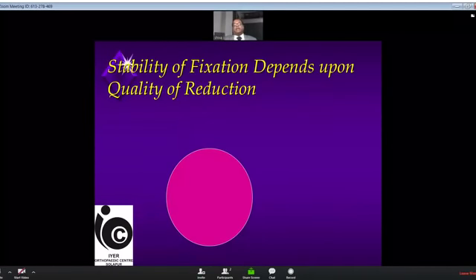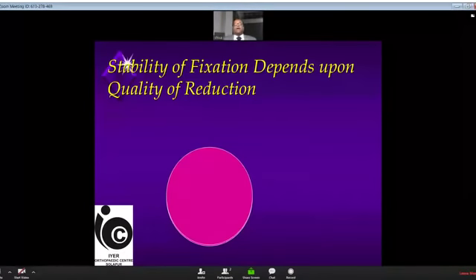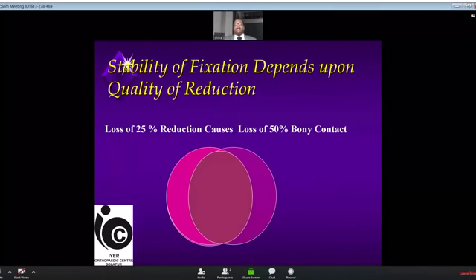Just to depict the anteromedial reduction, the neck, when it is reduced, both of them at the fracture site should overlap 100% like this. If there is a loss of even 25% reduction, there will be another 25% reduction loss posteriorly. So I am demonstrating in this fashion. You can see anteriorly as well as posteriorly there is loss of reduction. Only the central red portion is having the contact, where all the screws will come. Where is the bone to heal? That's why we face problems if the reduction is not proper. So anteromedial reduction is very, very important.